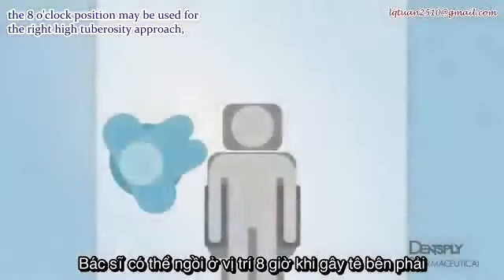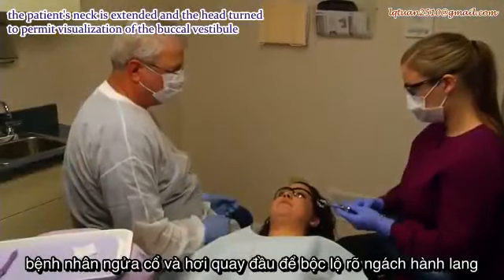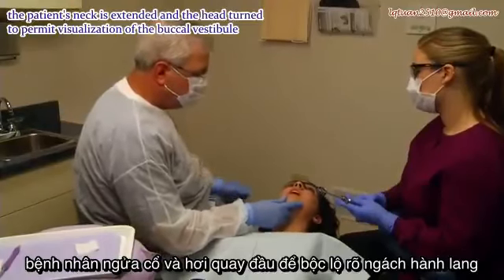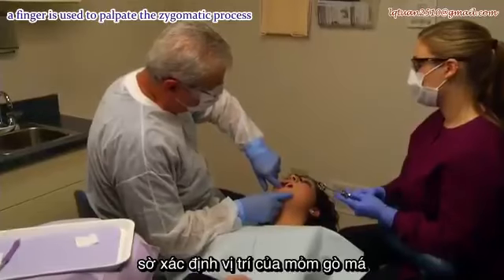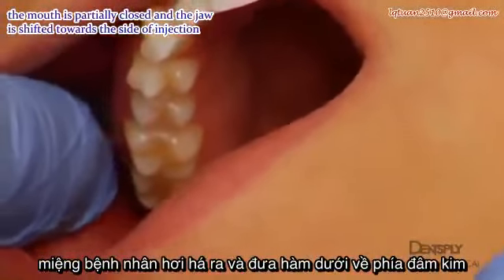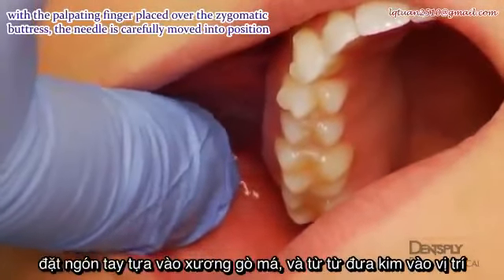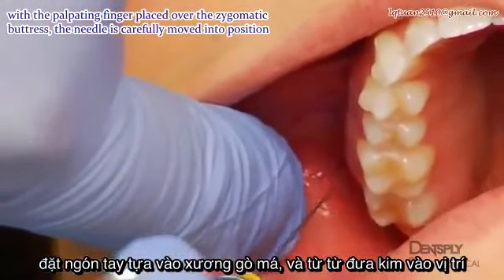The 8 o'clock position may be used for the right high tuberosity block and the 11 o'clock position may be used for the left. The patient's neck is extended and the head turned to permit visualization of the buccal vestibule. A finger is used to palpate the zygomatic process. The mouth is partially closed and the jaw is shifted toward the side of injection. With the palpating finger placed over the zygomatic buttress, the needle is carefully moved into position.